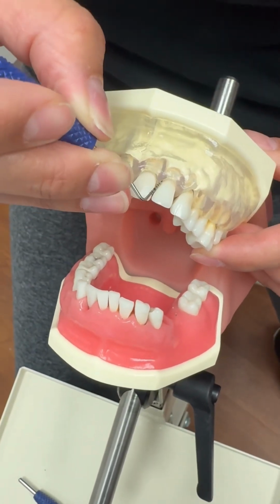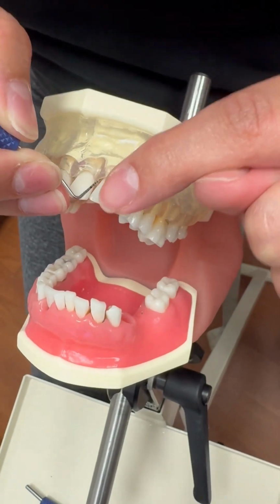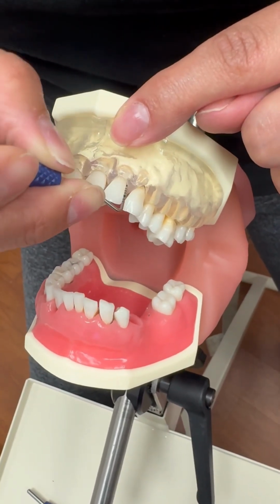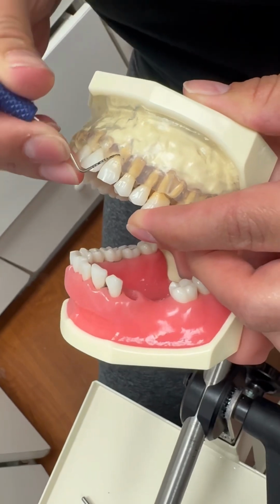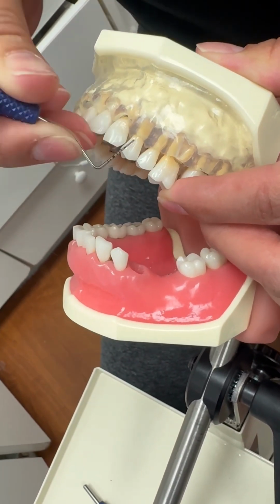The correct adaptation of this probe is to always keep it in contact with the tooth surface, and the angulation should be parallel to the long axis of the tooth. We measure depths from the gingival margin to the junctional epithelium.